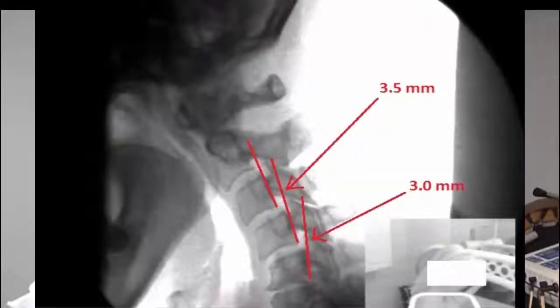We've been looking at whiplash injuries involving translations of one vertebra on another. The first one was at C1 and C2 at the top of the neck, where you see lateral variations when you go side to side. From C2 to C7, we looked at translations that occur when we look forward and maybe look backward. We've actually measured these translations in millimeters. What is the significance of that? All right, so we measured a movement.